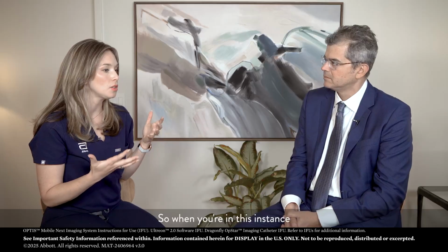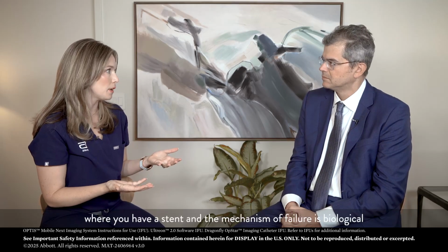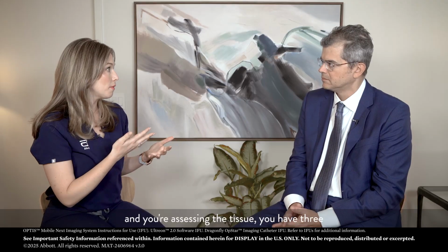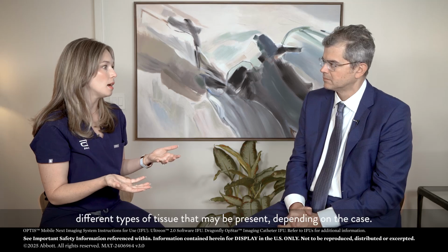So when you're in this instance where you have a stent and the mechanism of failure is biological, and you're assessing the tissue, you have 3 different types of tissue that may be present depending on the case. What is then the algorithm for treatment for that patient once you've assessed the tissue with OCT?